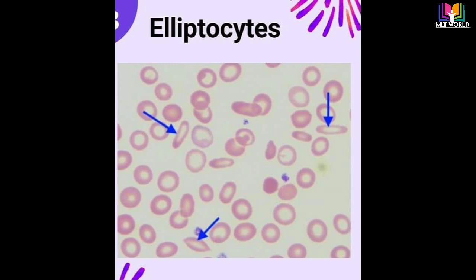First, we will start with elliptocytes. As the arrow is indicating, those RBCs are elliptocytes. Elliptocytosis is a hereditary disorder of red blood cells, and in this condition RBCs assume an elliptical shape rather than the typical round shape. Hereditary elliptocytosis is a congenital red blood cell membrane disorder that can cause mild hemolytic anemia. Symptoms generally include variable degree of anemia, jaundice, and splenomegaly.